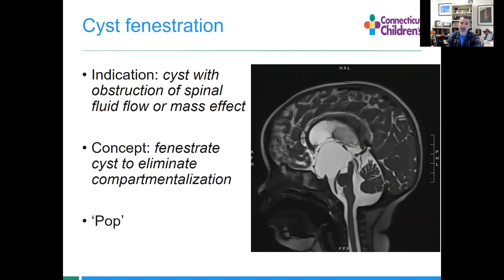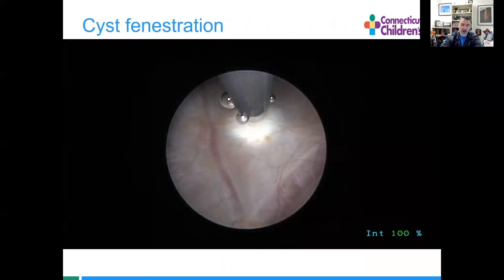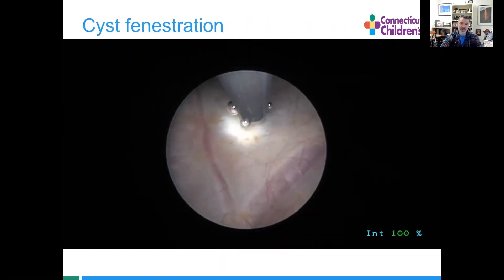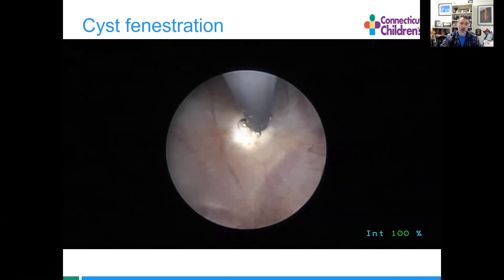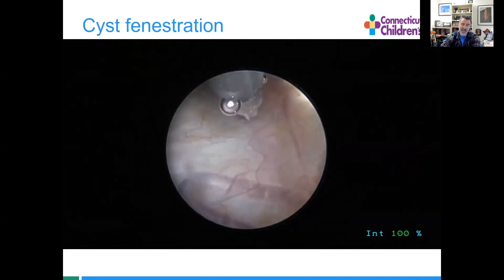There are other operations that we do. Here's a child who has an arachnoid cyst sitting within the third ventricle. We want to pop that so we can equalize pressures and reestablish CSF flow. The cyst is within the foramen of Monroe. We can see the septal vein, choroid plexus, as well as the thalamostriate vein. How we pop these is pretty straightforward — cauterize the capsule and poke our way through. This is not elegant surgery, but it's effective.